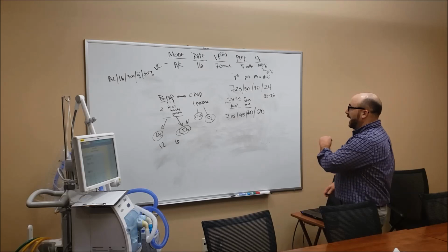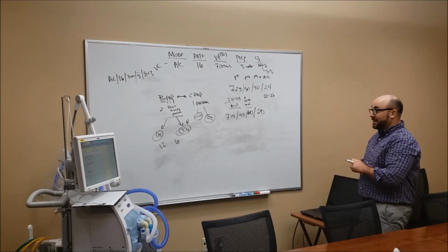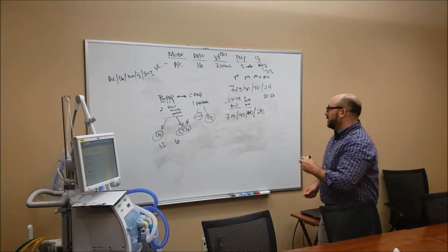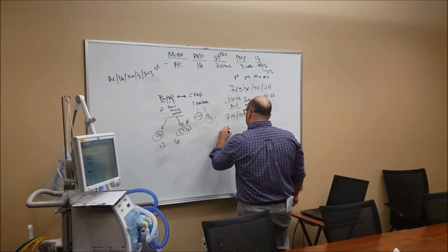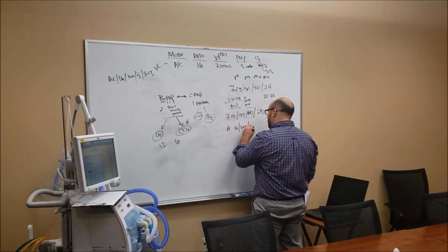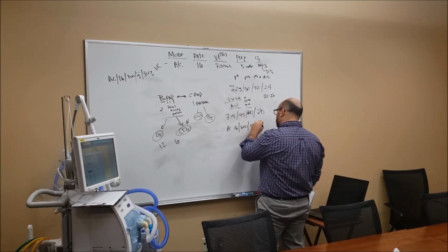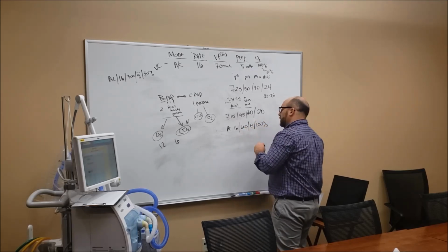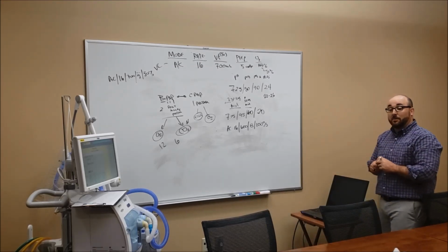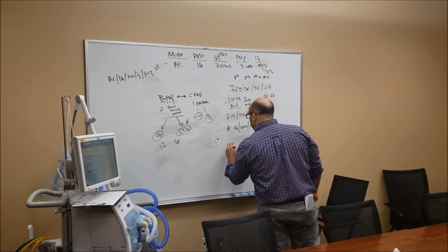So let's say we have this blood gas, and in this case, they're pretty sick. I probably wouldn't go with a BiPAP with this, so let's go with a vent. So I'm gonna give you some vent settings. So, assist control, rate is 16, 600, 8 of PEEP, and 100%. Let's do another blood gas, 1 hour later.